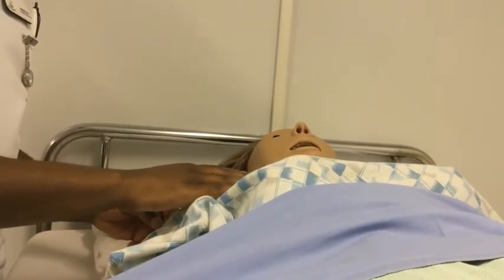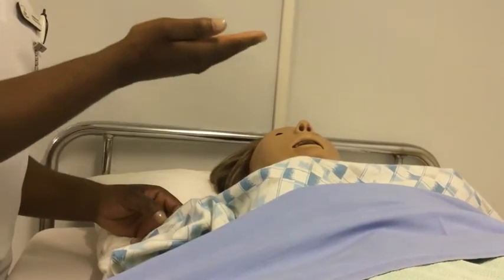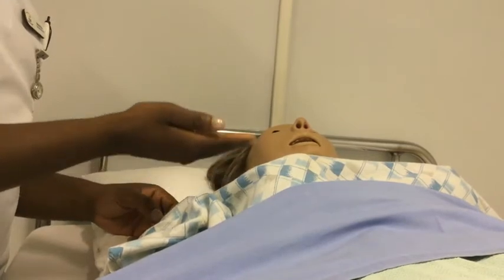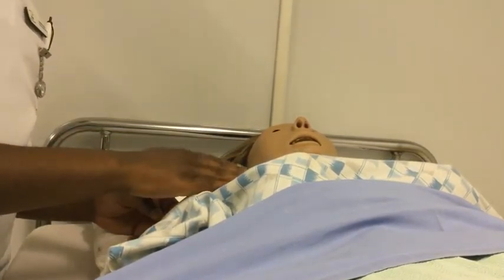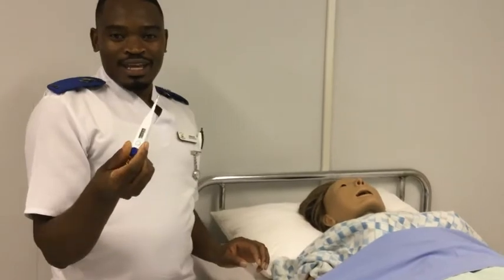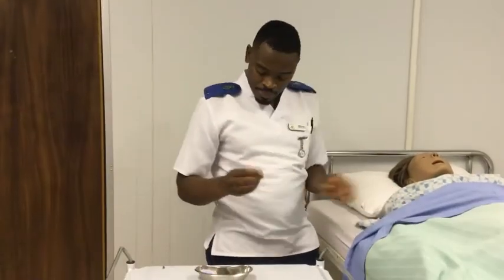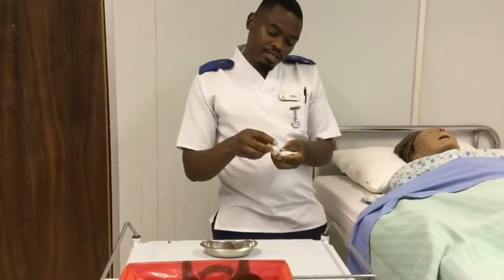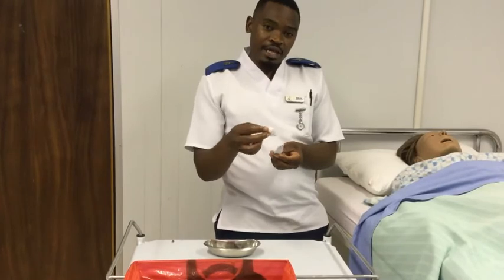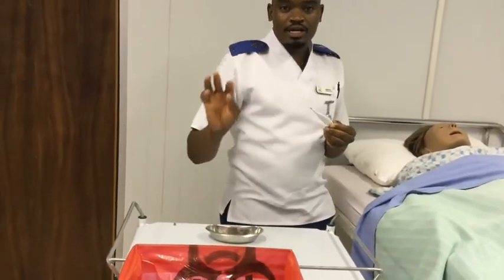Inhalation and exhalation — that is one full breath. So let's count together: one, two, three, four, until we have a full minute. And now we hear the beeping sound. Look at the patient's temperature — it's 37.5 degrees Celsius and it's normal. Now we have to clean the thermometer. When you clean the thermometer, we clean it from the cleanest to the dirtiest. We start from the top down to the bulb in a circular motion and discard.